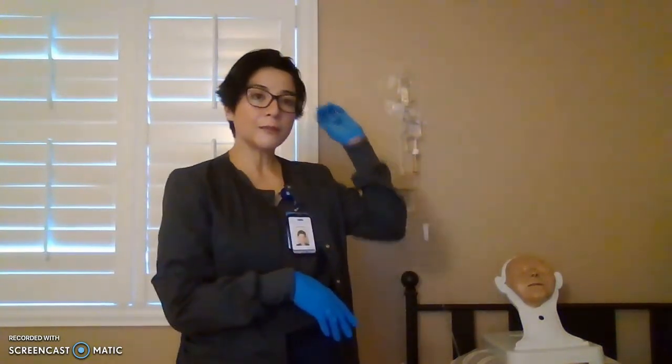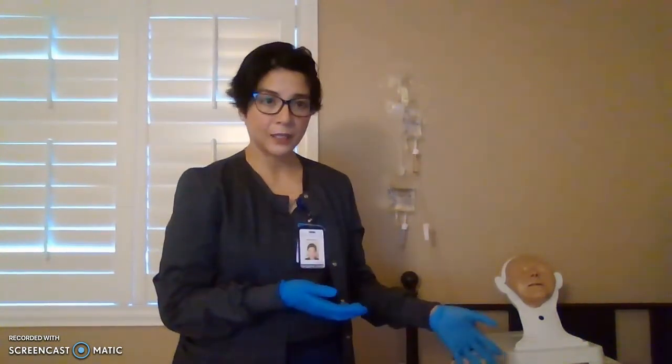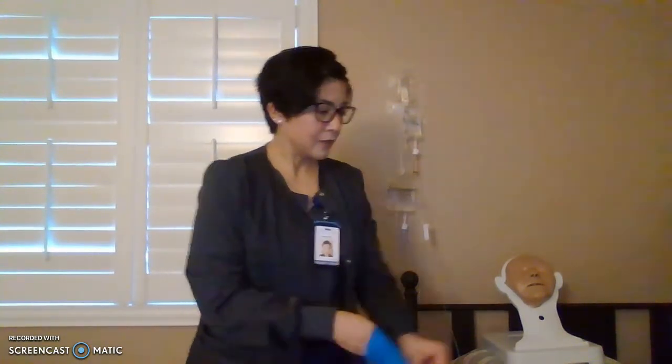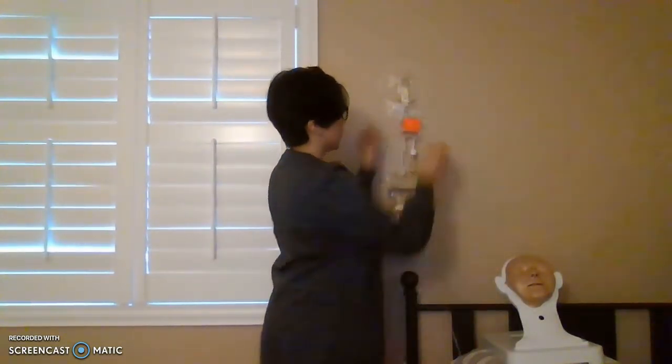Okay, so make sure you stay with your patient for a few minutes, document the procedure, and ask your patient to let you know if there are any adverse reactions. If there's itching, check the IV site, check the patient every now and then, go in the room, doff your gloves, hand wash. Make sure, by the way, you label your antibiotic with this extra medication label. Put it on your additional medication. All right, so that's it.